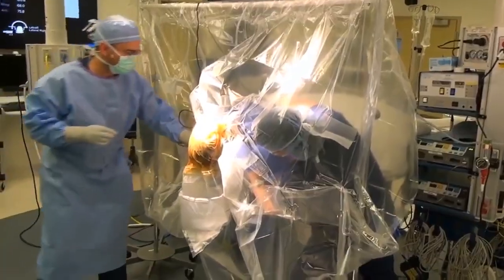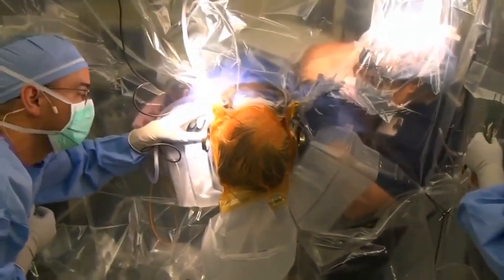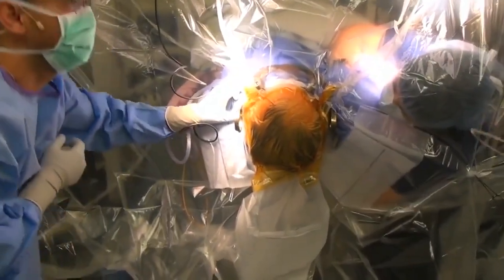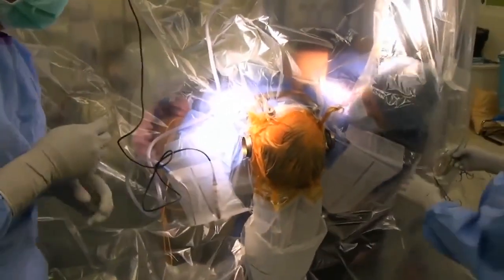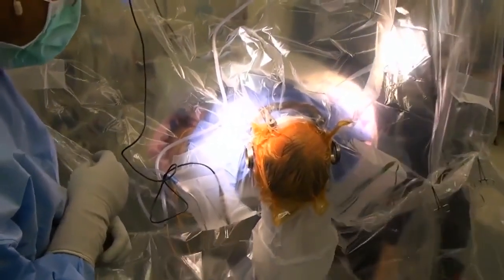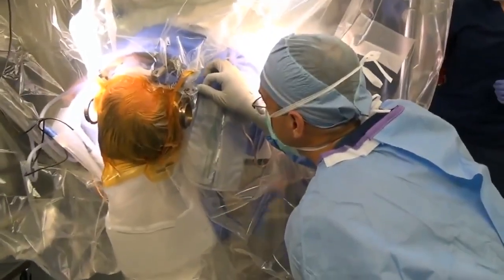So here we just always double check each other. At least 2 eyes at all times, checking the coordinates. 120.8 and 97. Okay. All right, you're good over there? Yeah, we are. 97. Yeah, 120. All right, good. All right, you want to go ahead?